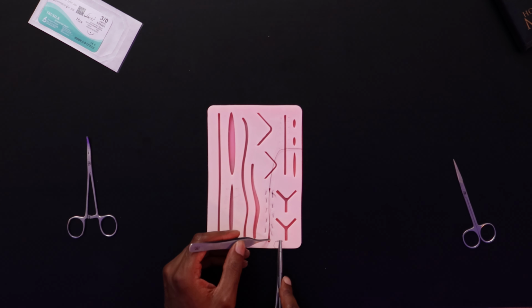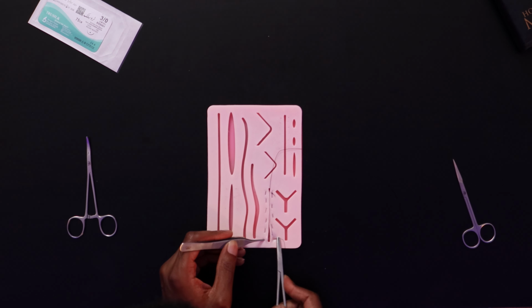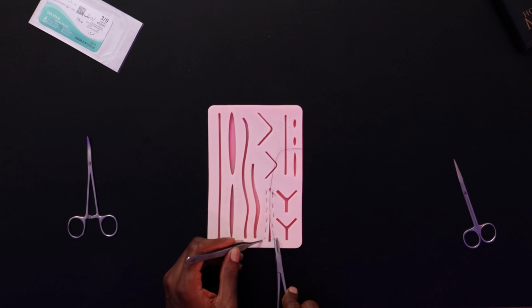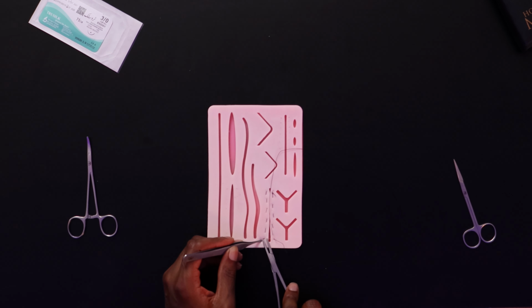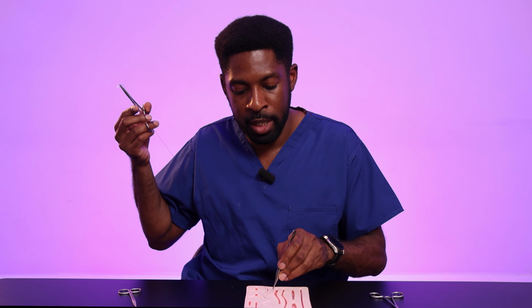Now, as we've done before, to complete the suture and tie off at the end, you perform one more pass of the suture. Again, using the curve of the needle to pass it through, leaving a loop of adequate length to tie off on the other side. You can drop your needle down.